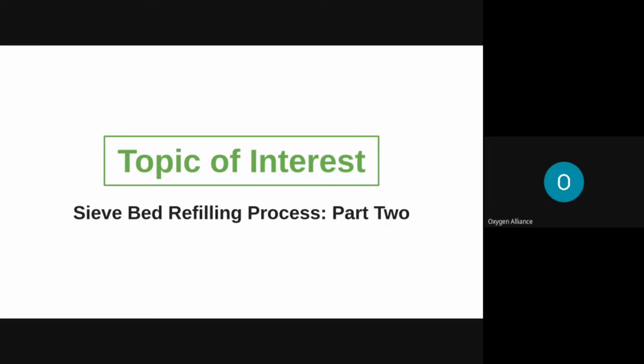Thank you, Maui. I see time is not on our side very much, so I'll try as much as possible to go through the topic quickly. Last week, at Concentrator Talk, we had the topic of interest where we talked about the sieve bed refilling process. I mentioned that the process of refilling sieve beds starts from opening the sieve bed, cleaning, refilling, closing, and up to pressure testing them.